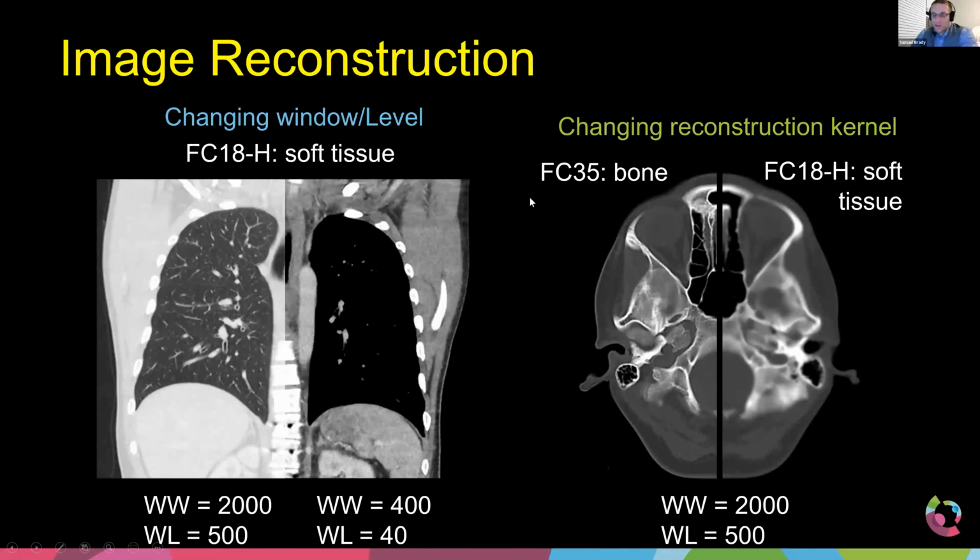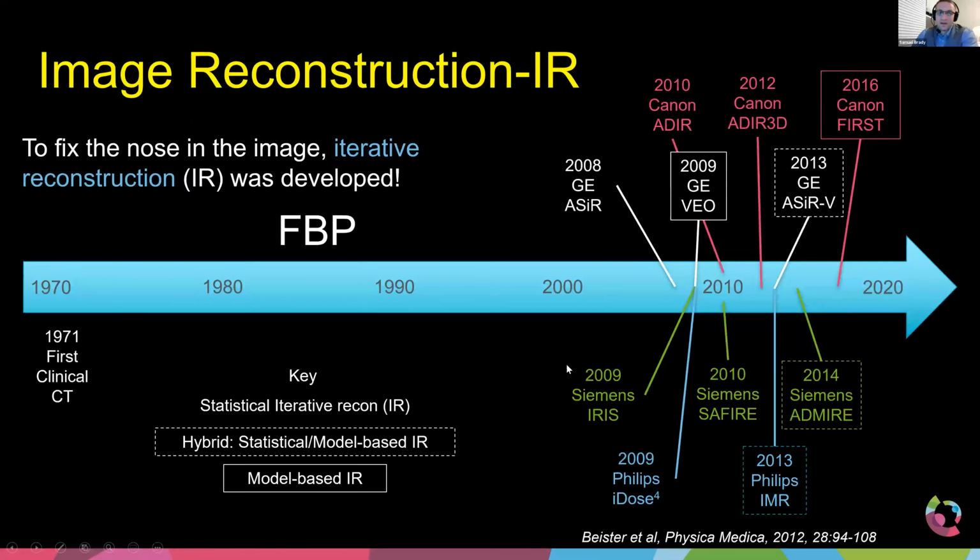So obviously I shared this with you last week. Obviously it was for the head, but it shows the idea that setting the various different reconstruction kernels directly affects how the image is created. And therefore we can tolerate a little bit more noise in this type of image because the bony anatomy already has such a high contrast compared to the background. We don't have to worry if there's a little bit more noise here. Whereas if we're doing soft tissue imaging and you have a soft tissue lesion somewhere in here, a little bit of noise over that would obscure it.